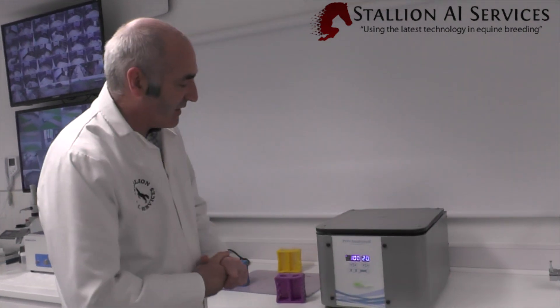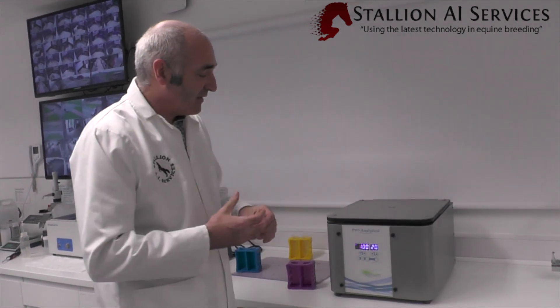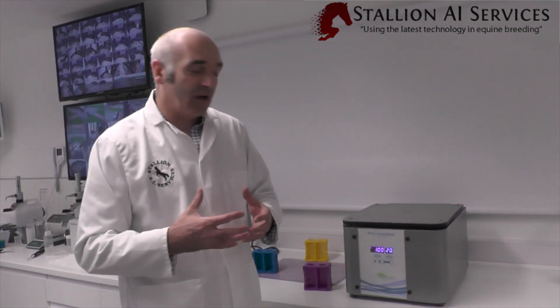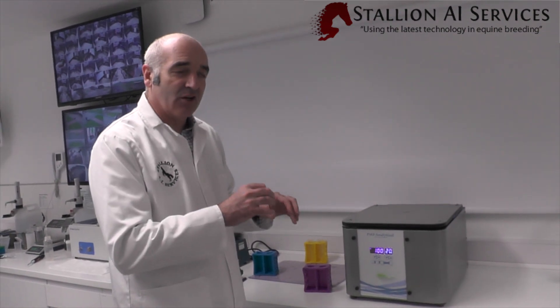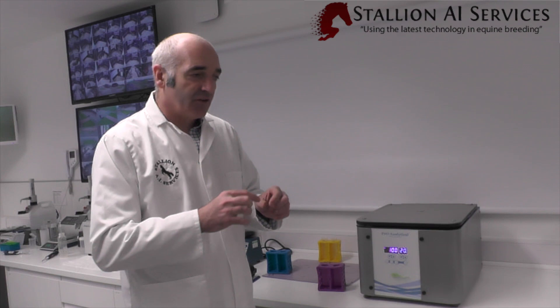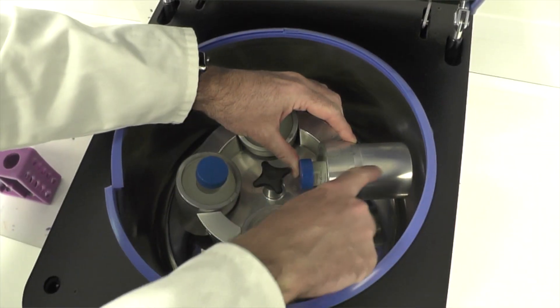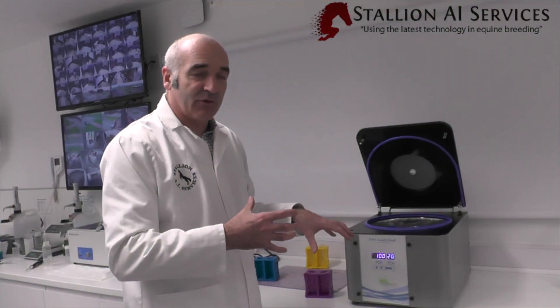When spinning the semen down, you've got to pick your desired rate, which can be measured either in g-force or RPM — revolutions per minute. A lot of centrifuges only show RPM, so you need to find out how that correlates to g-force. There is a simple formula available online where you measure the radius, plug it in along with your RPM, and that will give you the g-force.